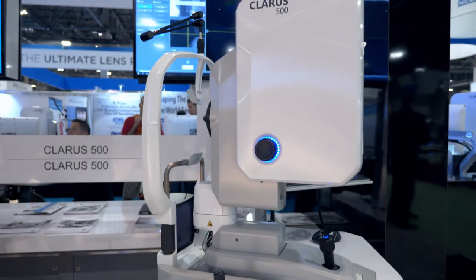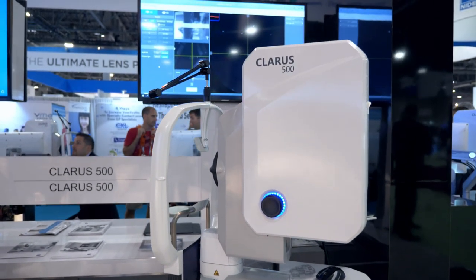Zeiss has always been the forefront leader in a lot of medical technology, especially in eye care. And they're doing the same thing with ultra-wide field photography now. Ultra-wide field has been around for a few years and it's been getting more and more popular. Clarus is, in my opinion, the newer generation of ultra-wide field.